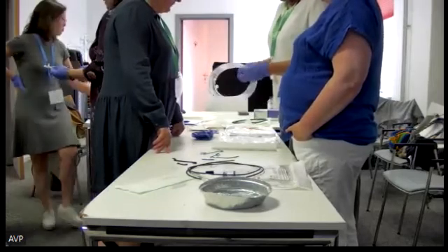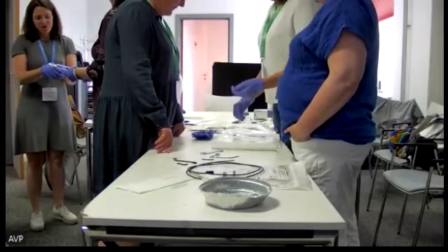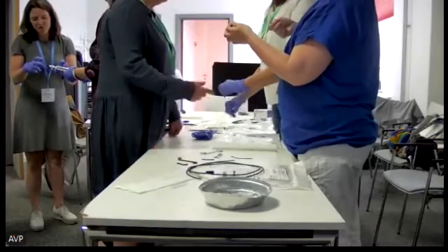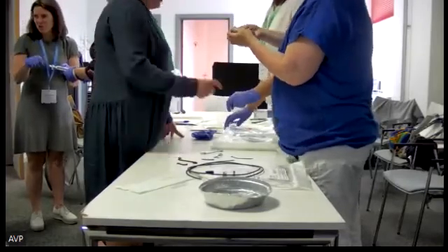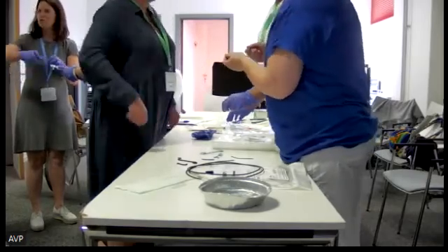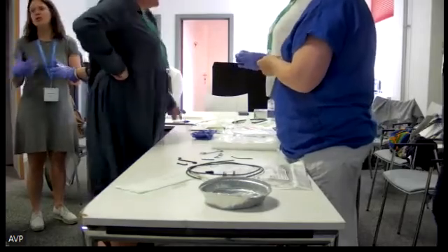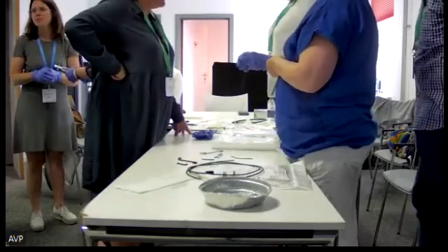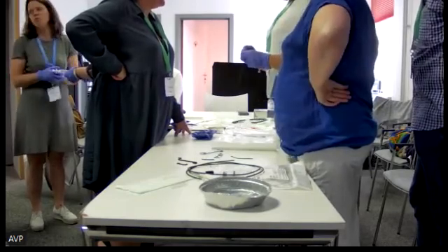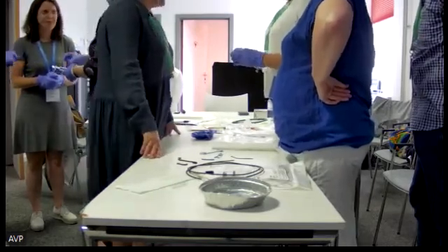Well, this might also bring more tissue, the aspiration. So now we don't always do aspiration. It's not the first step, but if you're afraid that the lesion will bleed, then we might just put the needle in and do a slow pull, slow stylet. The slow pull is when you're afraid the lesion is going to bleed. But usually for solid pancreatic adenocarcinoma, we do use suction, though we don't use much.